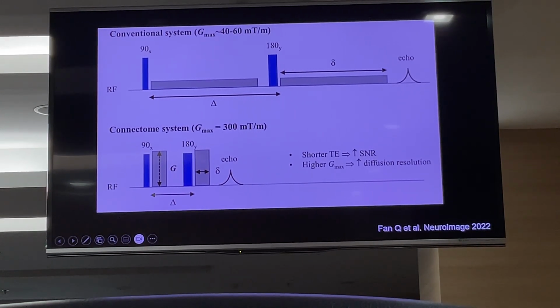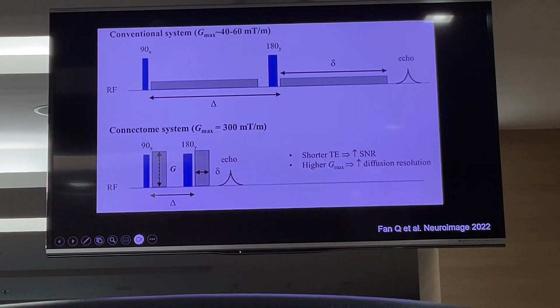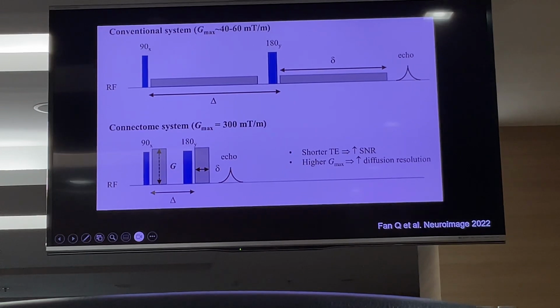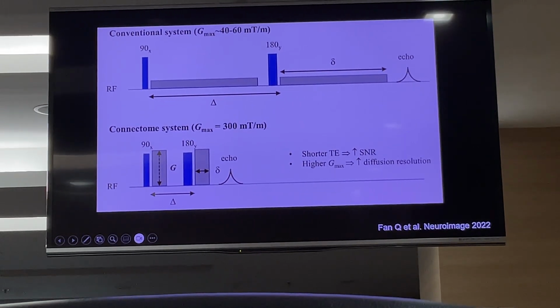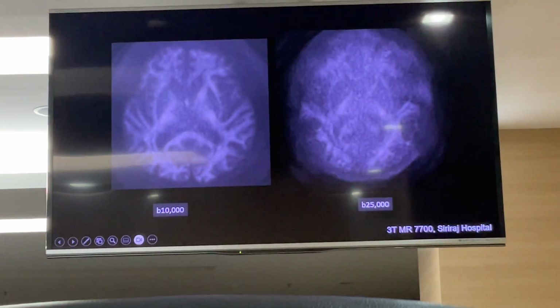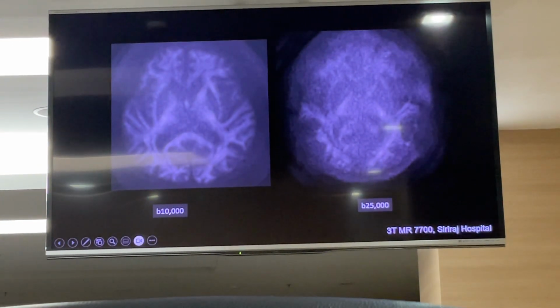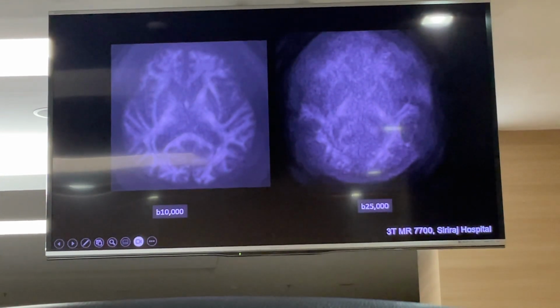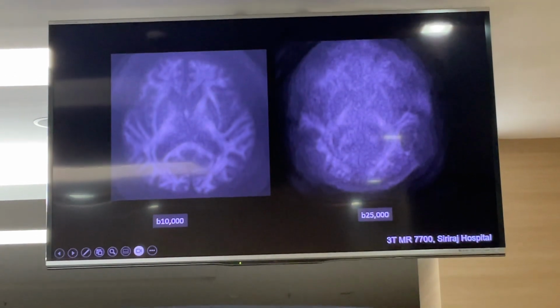But for research, like MRI research using diffusion imaging, you might want to increase the gradient to characterize the pathology of the brain, like advanced diffusion models. For the clinical scan nowadays, you can increase the B value over into the high regime. Yeah, for using it in clinic, and also for advanced diffusion calculation, right?